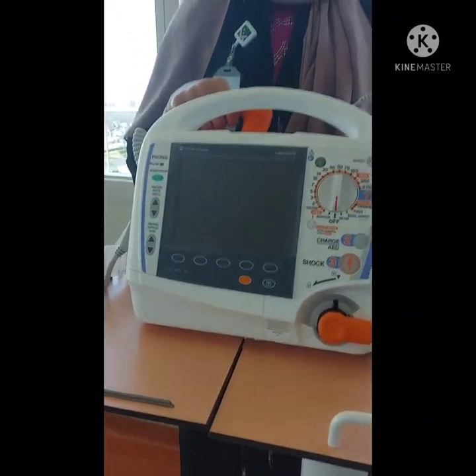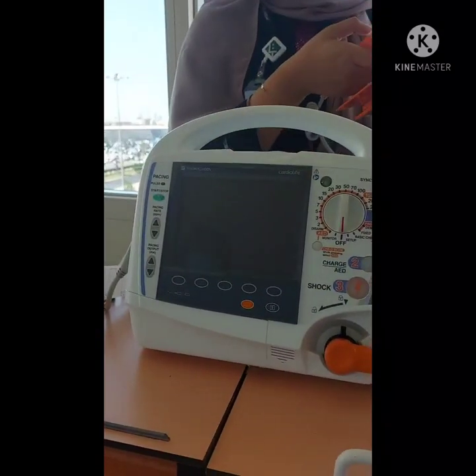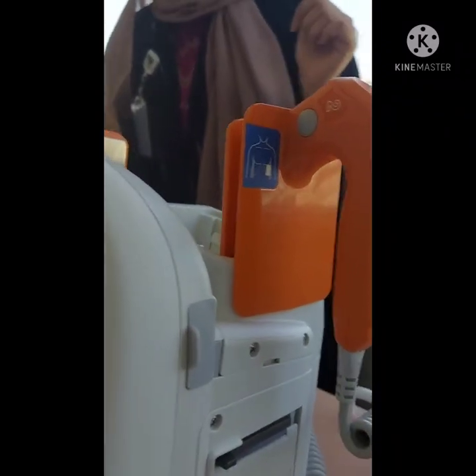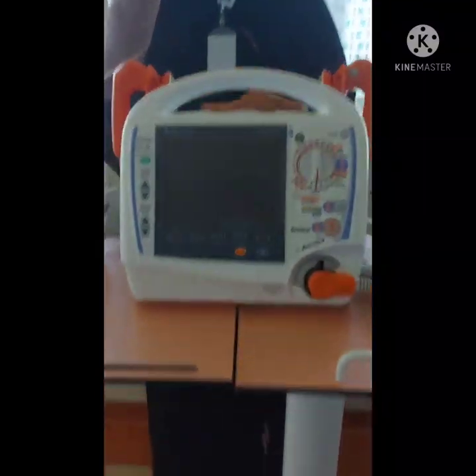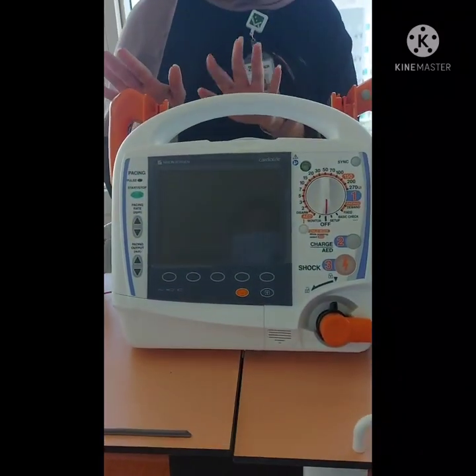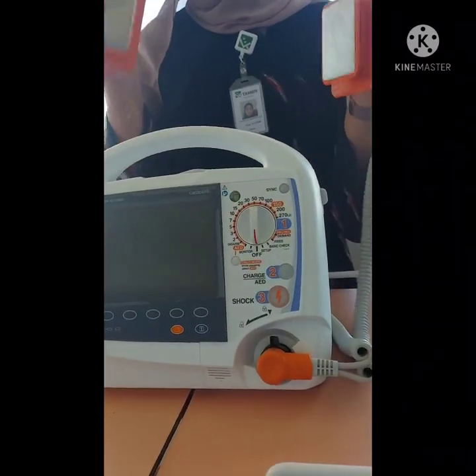Okay. So there is another thing that helps the nurses a lot. When you put the gel on the paddles and the patient is not ready yet for the shock, you can just keep the paddles like this. Because sometimes there is the gel, but it's not directly contacting the patient. It will hold up until 1 minute and 30 seconds until you go and discharge the patient.